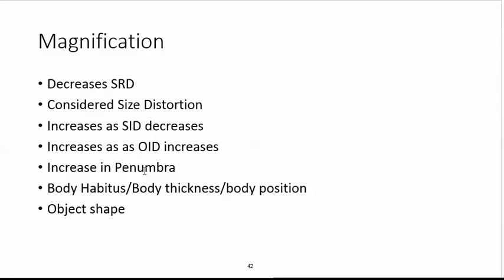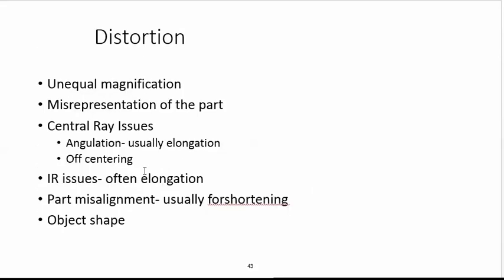So if it's away from the image receptor, we have an increase in OID. The increase in OID, we have magnification. So we shoot those exams naturally at a longer SID. So most of the exams that we shoot at 72 inches, what we're trying to do is overcome the magnification and loss of sharpness or recorded detail. We're trying to reduce the penumbra and reintroduce that sharpness, and again try to represent the anatomy in more of its normal size. So exam type also can drive magnification.